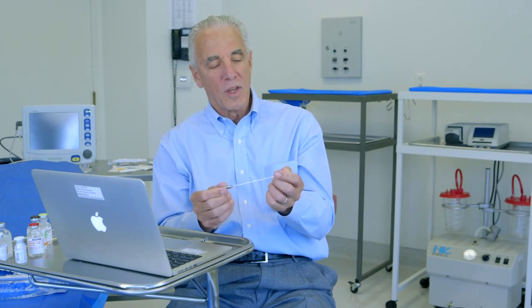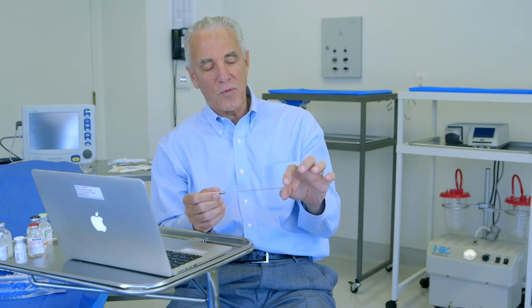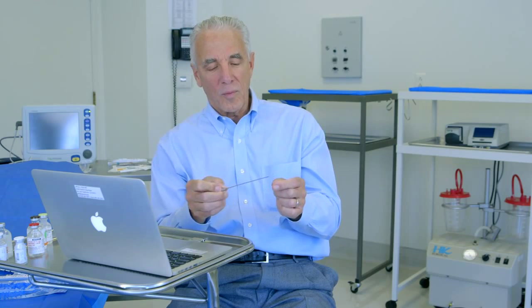If we had just infiltrated out of the tip of this, there'd be a rapid distension of the fluid under the skin, and that would be uncomfortable. This spreads that infiltration, that volume, over a larger distance and reduces some of that discomfort from this rapid distension of the tissues. And we can then move this from area to area very carefully, and in that way minimize any discomfort. And essentially, it's a painless tumescent infiltration technique that we've developed.